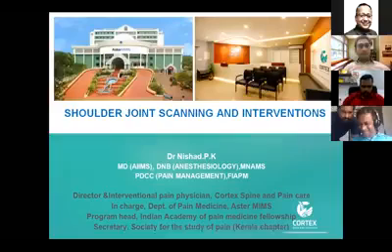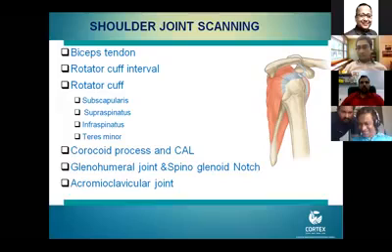Okay. Thank you, Dr. Avnish, for the nice introduction. Good morning, all my seniors and dear friends. So today I will be talking about shoulder joint scanning and interventions. The first part of the presentation, first 10 minutes, I will be talking briefly about how we do a shoulder joint scanning, and the second part will be a small video presentation on the common pain intervention in the shoulder. We know ultrasound is the best tool to do a dynamic examination of the shoulder joint in the OPD itself.